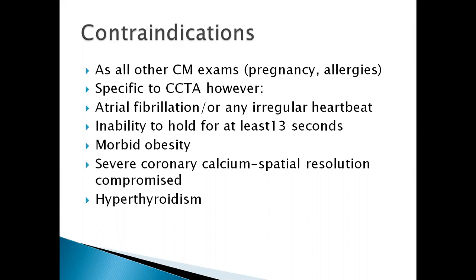And then for patients that have allergies, especially to iodine, you may want to pre-medicate the patient before the examination, or at least for our center, that's what we do. We pre-medicate the patient, and then we book the examination for the following day.